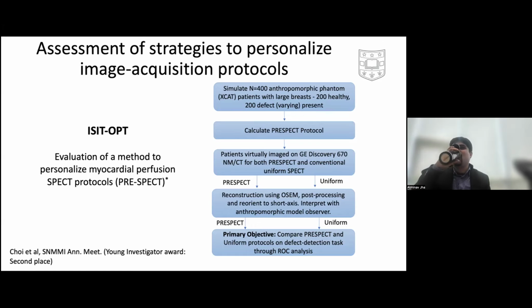The VTT opt trial, where we're optimizing how much you're injecting into the patients based on the digital tool we're building, coupling the PBPK with the PD and seeing if the patients respond better. I guess the primary objective would be to see if patients respond better to therapy compared to a one size fits all. Primary, I don't know what the secondaries are.